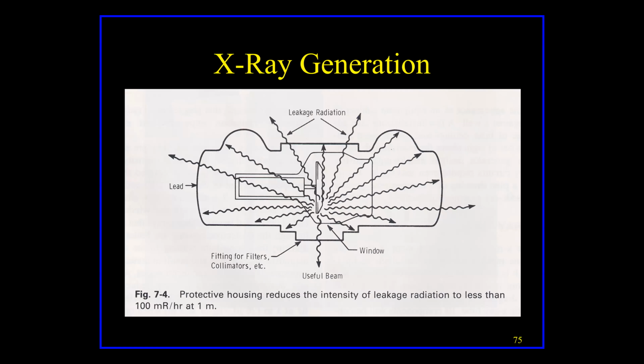So X-rays are generated by the anode, and they are generated in every direction possible. So when they come, they produce right in here by this target of the anode, and they fly off in this way and this way and every which way. But this entire glass X-ray tube is encased by this lead-lined head on the X-ray machine right in here. So every X-ray that's produced by the X-ray tube that goes off in any direction other than what is allowed to go out this way gets soaked up or gets suppressed by the lead shielding around the X-ray tube.